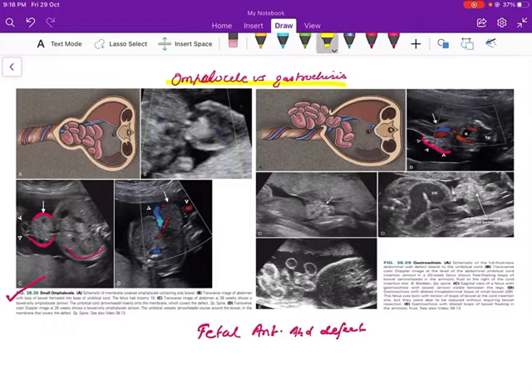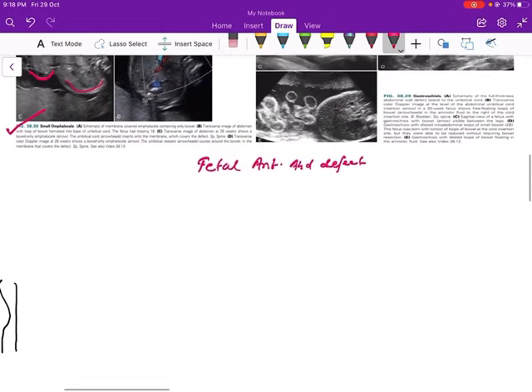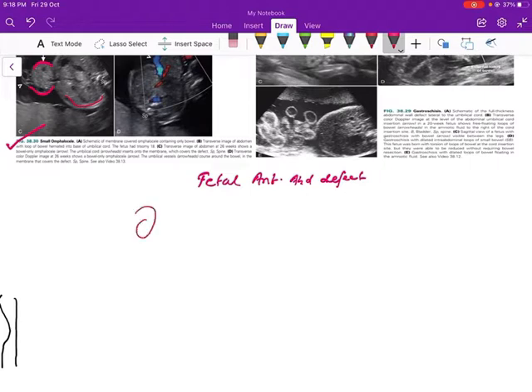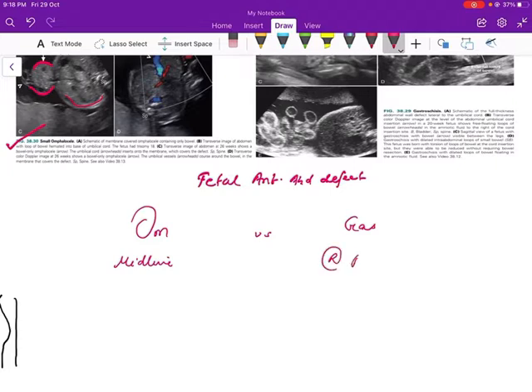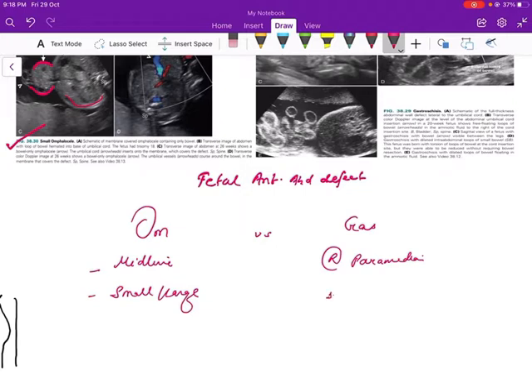Now for the theoretical comparison: omphalocele is a midline defect while gastroschisis is a right paramedian defect. The defect can be small or large in omphalocele, while in gastroschisis it is usually smaller — around 2 to 4 centimeters.